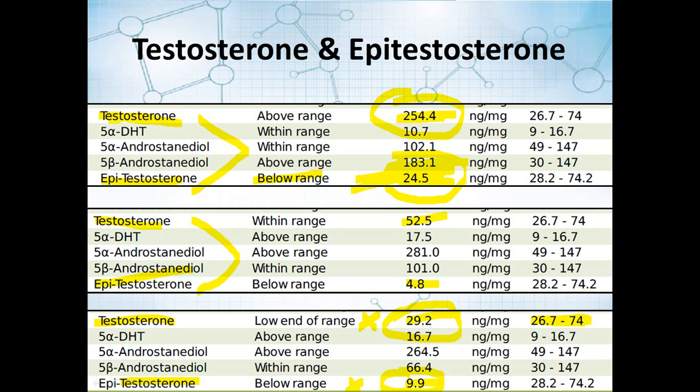Now, the relationship between testosterone and epitestosterone as a baseline in terms of that 1-to-1 ratio, it's not quite as rock solid as I would have hoped going into this, so it's a real rough approximate. But one, we're using it to look for that defect, so it's important for us to have it, and two, sometimes with supplementation, it gives you a little better feel for what's going on, so that can be helpful sometimes.